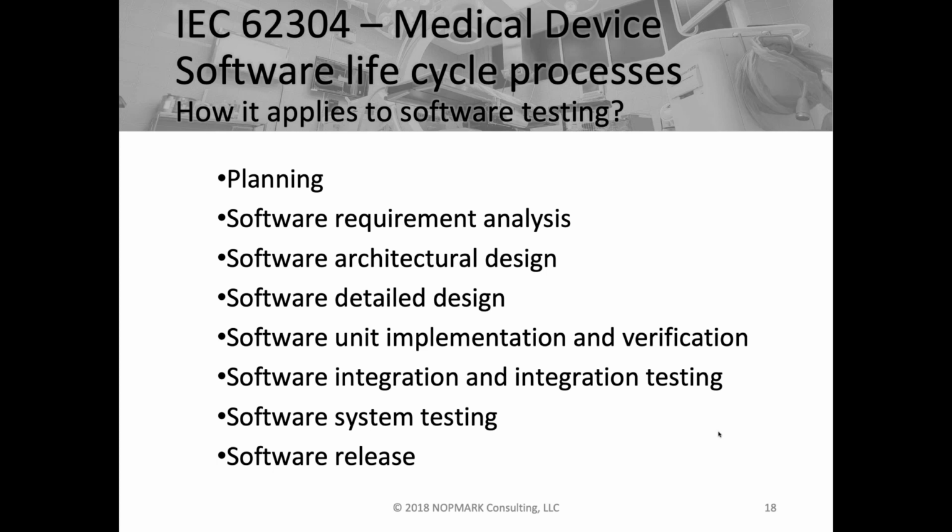If you're in a class B, your verification could be a static review, a static test, where you have a review meeting with the team looking at the design. If you're in the more safety critical class C, these are actual test cases that you have to create that will trace to your architecture for the high risk components or the high risk areas of your software.